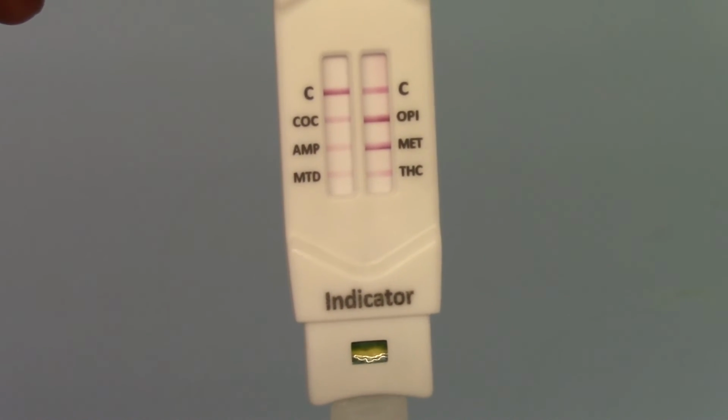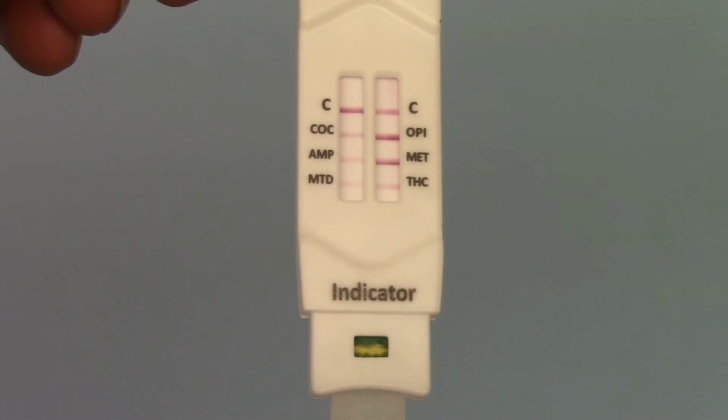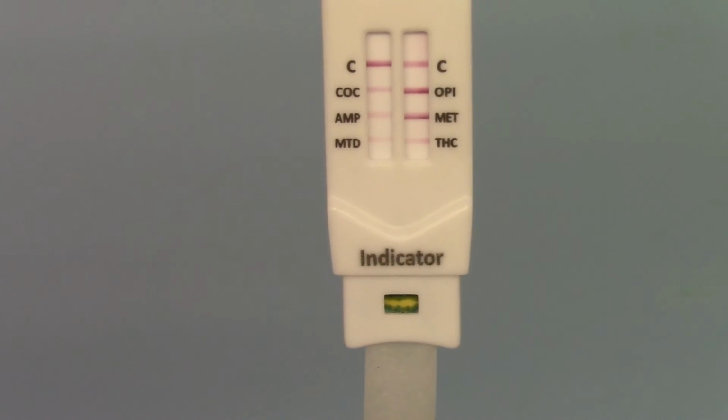You'll see this variation. So there you have it, a nicely run 6-panel saliva drug screen giving you an all negative final result on that sample.